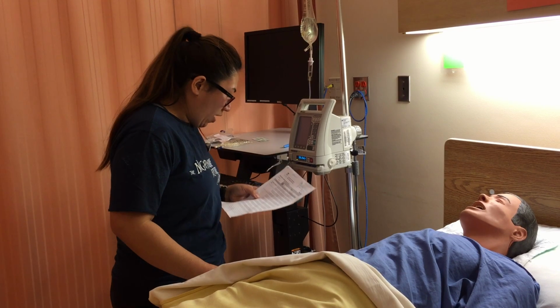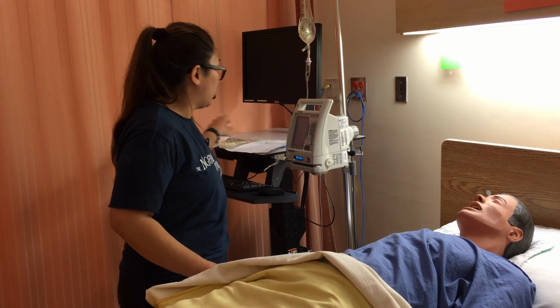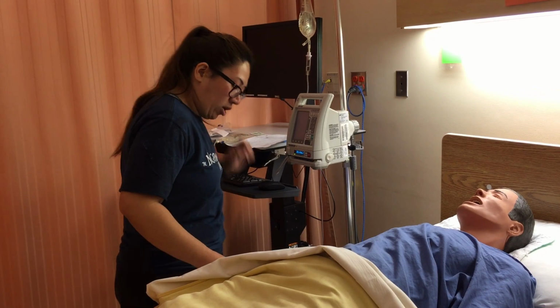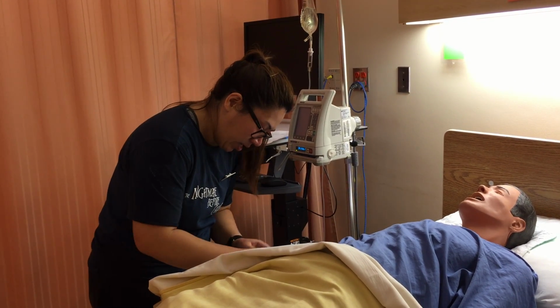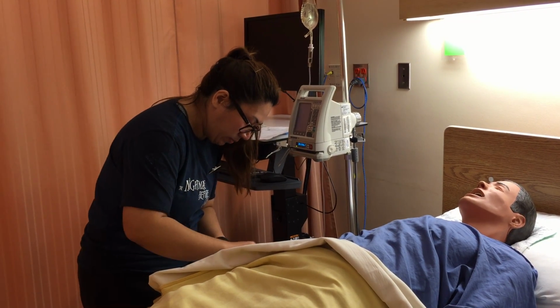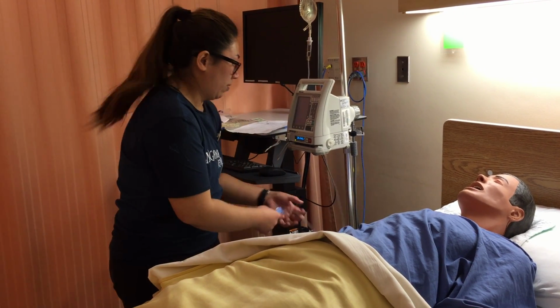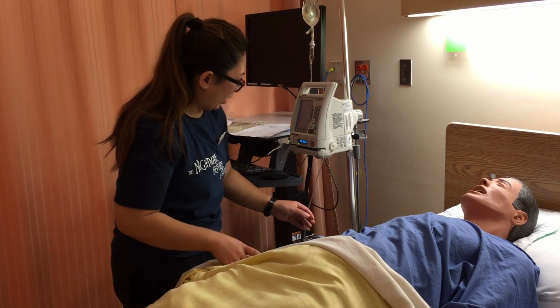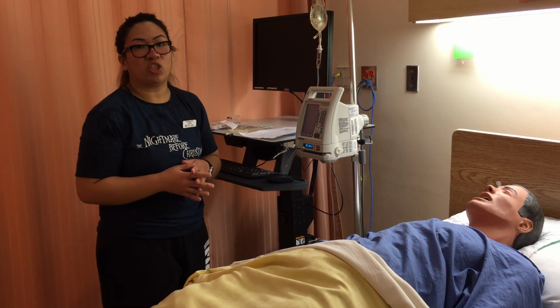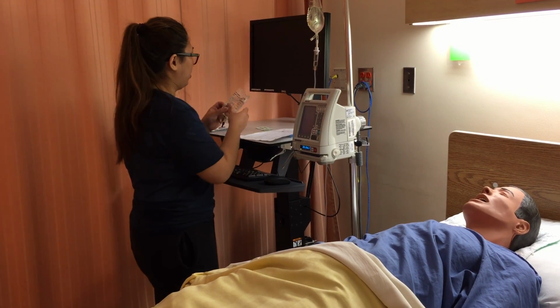Can I also ask if you have any allergies, Mr. Medina? All right, good. Just to make sure, because this medication is contraindicated with penicillin as well. Thank you. Can I also just check your IV site? No tenderness, no inflammation, it's not warm, and the IV is running good. I'm just going to fix this a little bit. All right, and I'm just going to hang this medication. At this time, I would do my third and last check to make sure everything is right, and I check my patient at the same time as well.